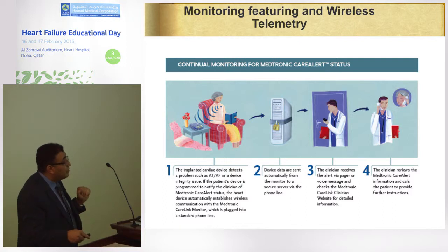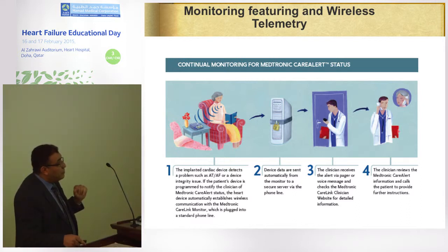This is sent to a monitored, secure center, and then this gets transmitted back to the doctor. It could go through emails, or it could even go through a message to the doctor. We do have these capabilities here.